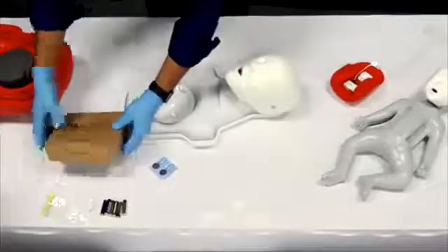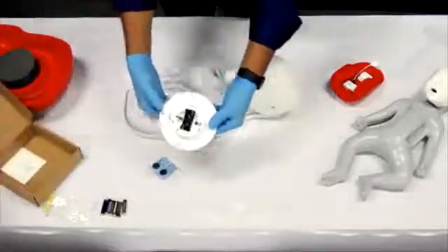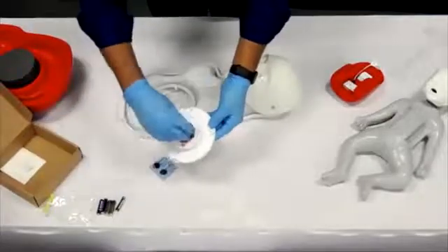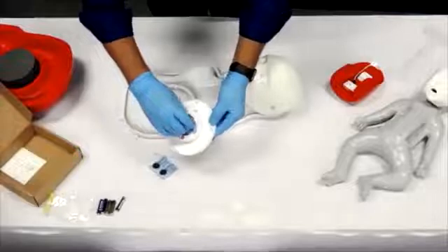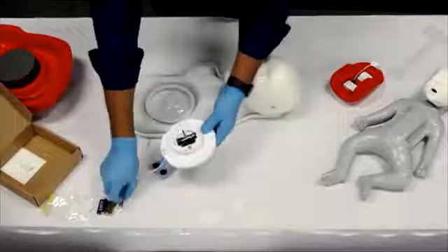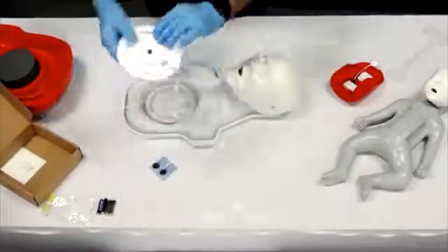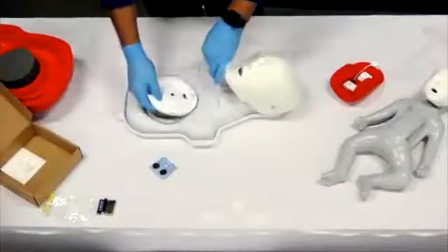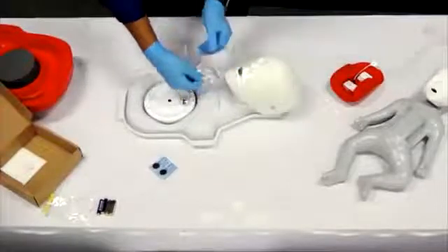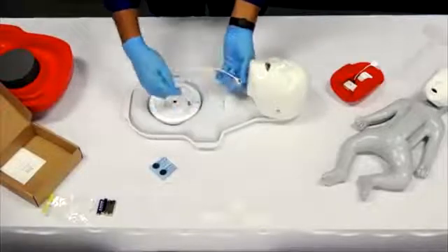So the Basic Buddy Plus electronic component also requires two AAA batteries. Install them paying close attention to battery direction. The electronic component sits on the white base of the mannequin. Place the electronics so the breath sensor cord is towards the head of the mannequin. This cord then snaps to the breath module sensor.